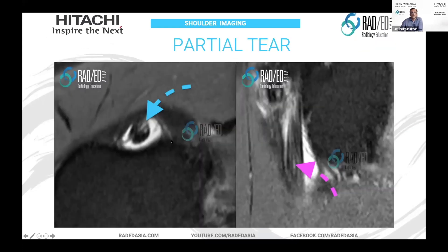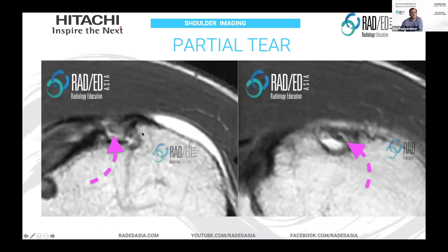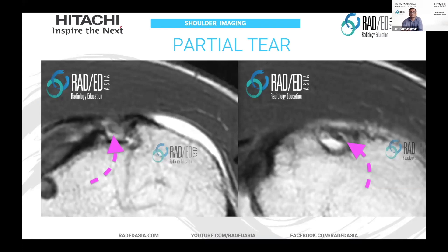In other appearances, we've got degeneration but we've also got small areas of tearing. So you're really looking for these areas where there is increased signal similar to fluid signal. Looking at this case, this is another appearance of tearing where you have a tendon that is incredibly thin. This is not the normal size of a biceps tendon — it's very, very thin. What's happened is that most of the biceps tendon fibers here are torn. There are only a few fibers left — these are the remnant fibers. So this is a partial tear as well, but it just has a different appearance where we've got thinning of the tendon.